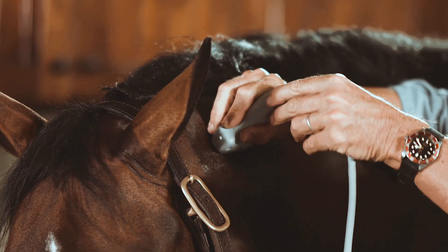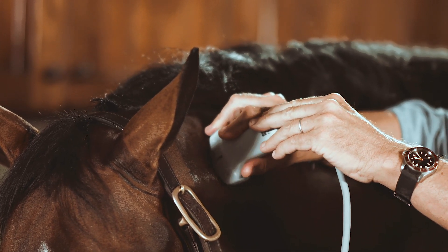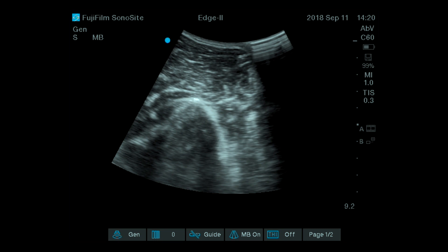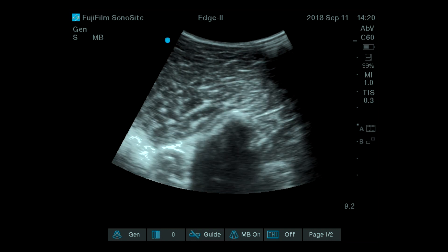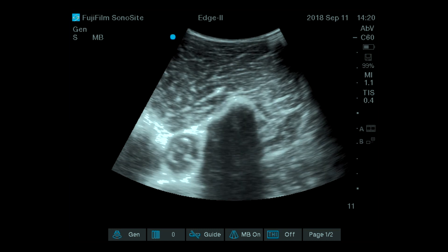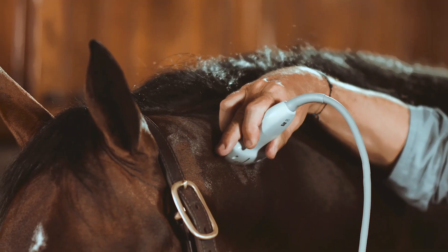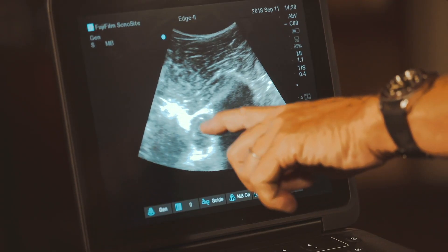If we move the probe exactly 45 degrees, you are going to get just to the edge where you can see the medulla canal. We know there is a gap between these joints where there is much more ease to get exactly at the edge of the medulla canal. This is a spot you definitely do not want to aim if you are injecting the joint between C1 and C2. So I come back to the joint, then move my probe 45 degrees, and I get to see the medulla canal just here at this edge.